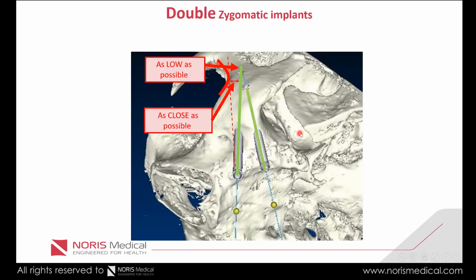And now the posterior implant also has a boundary. The boundary is not falling into the temporal fossa, even though in some cases it is not a rule. But when we do, we are injuring the masseter muscle, which is here. But in some cases, the only way to position a posterior implant would be to go from the infratemporal fossa, entering here, towards the bone, because this would be the place where the bone of the zygoma is.